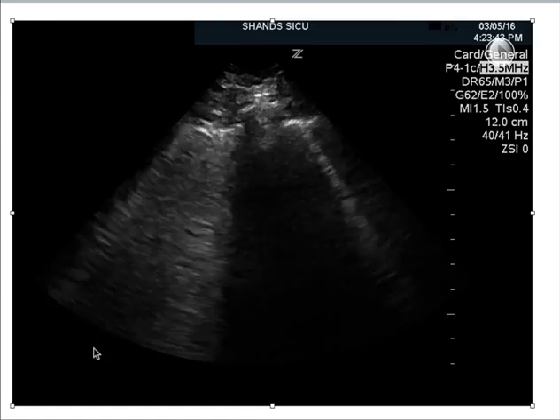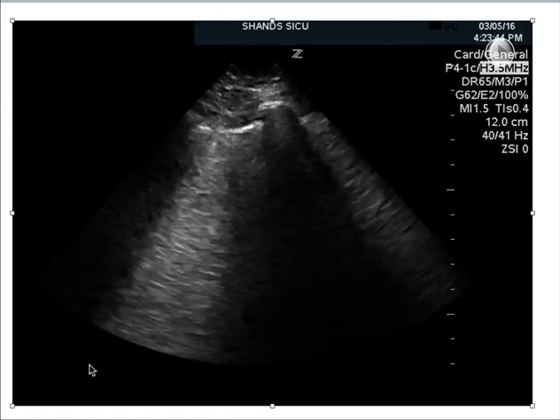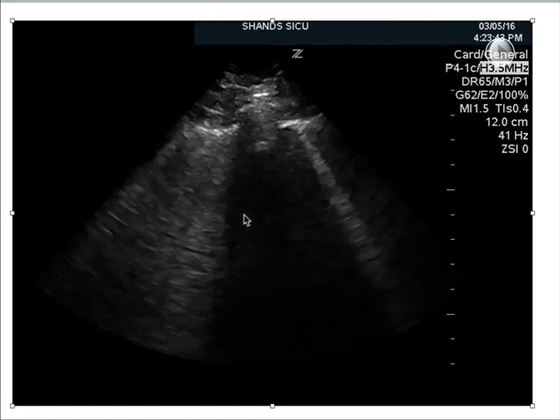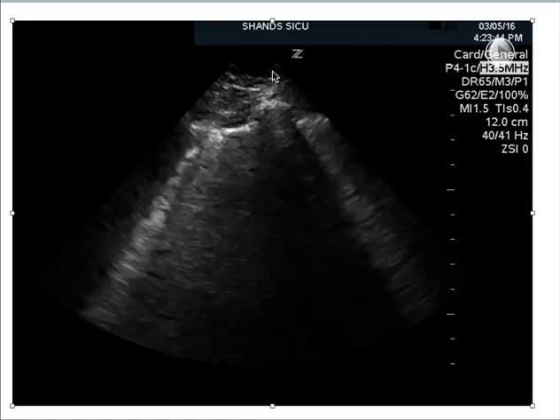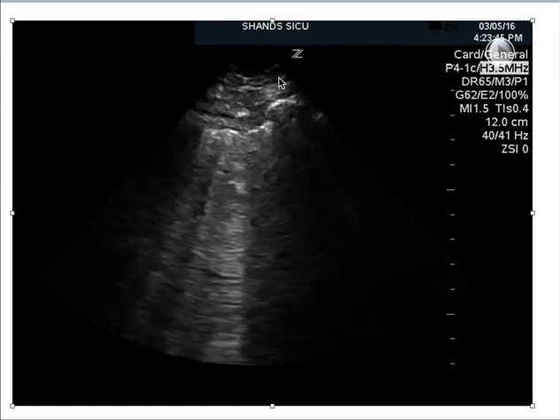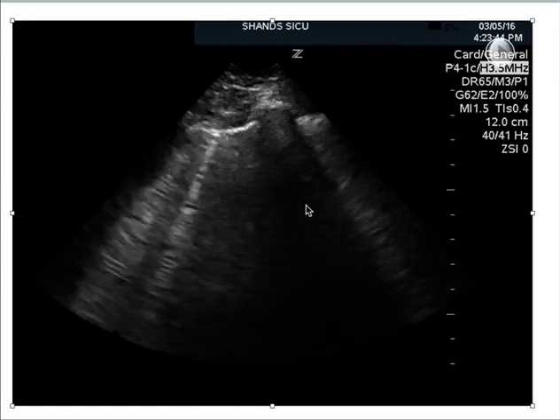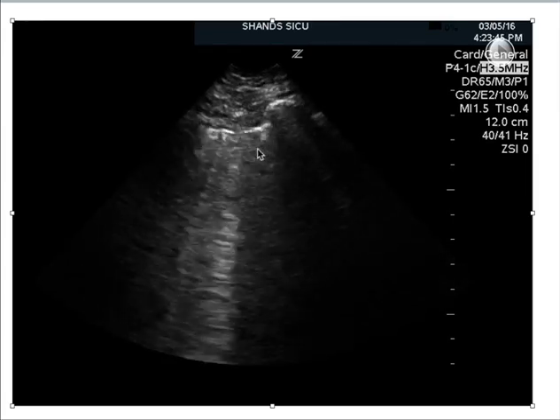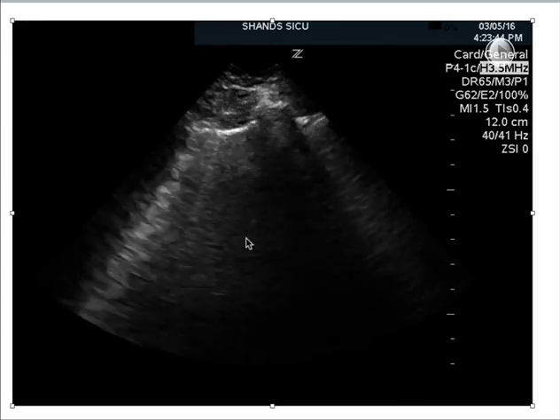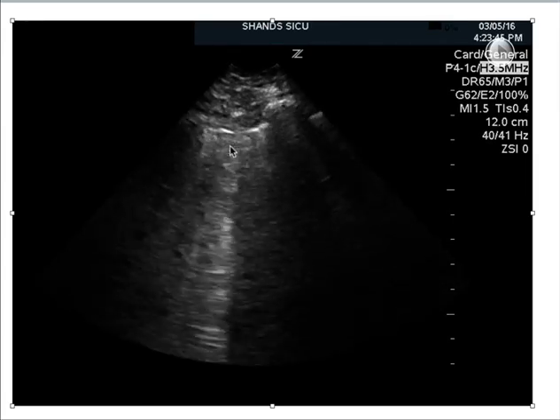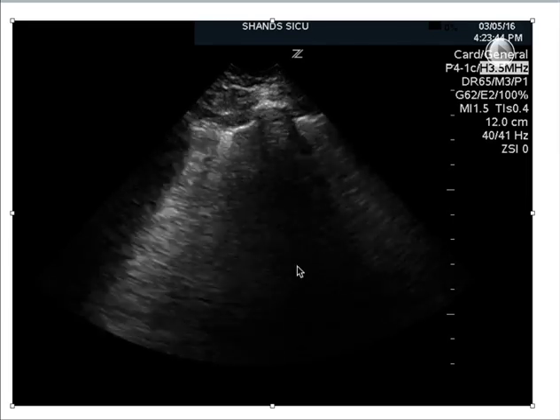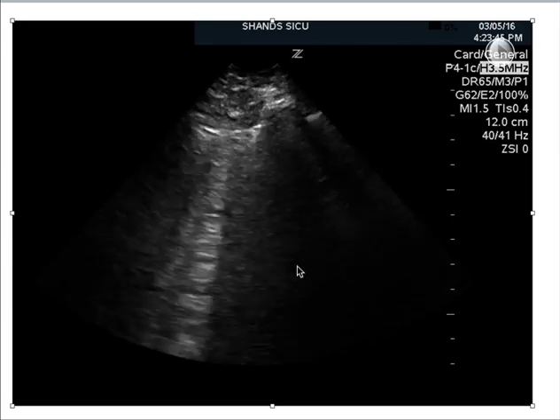Here's a patient with lung sliding. If you were unable to see before, you can see definitely with this — even though the chest wall is moving, you can also see the B lines are moving back and forth. You could zoom into the pleura and look a little bit closer, but once you do a lot of these, you'll be able to tell fairly quickly.